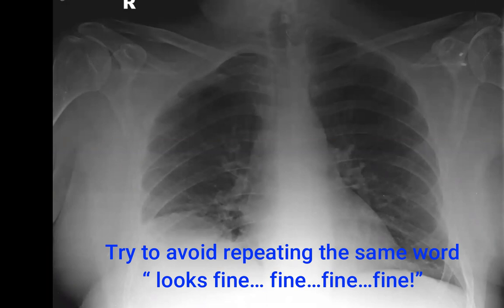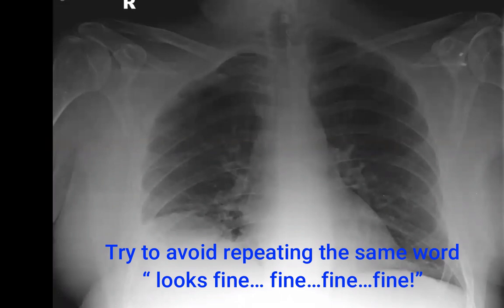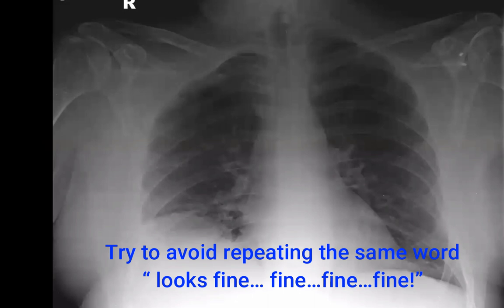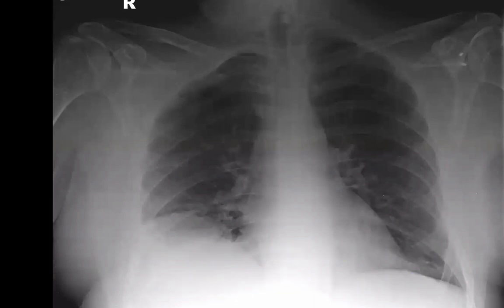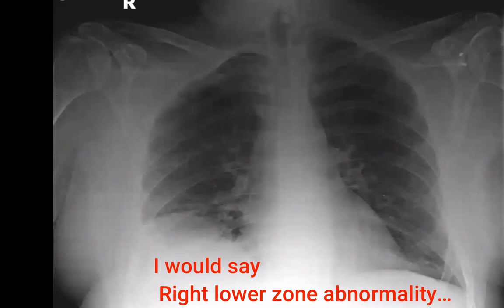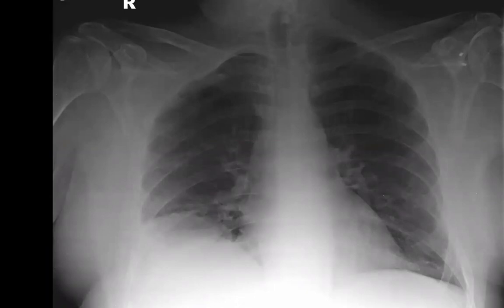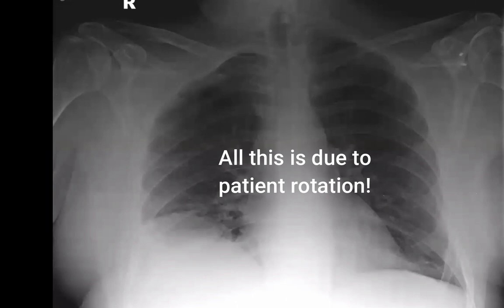The lung fields, other than the right basal opacity, look fine. Regarding the skeleton, the clavicles are fine, the shoulders are fine other than the left shoulder surgery, and the scapulae are fine. I cannot find any other soft tissue abnormality. So in summary, there is right basal pulmonary consolidation probably, and a right paratracheal shadow and a right root of the neck shadow.